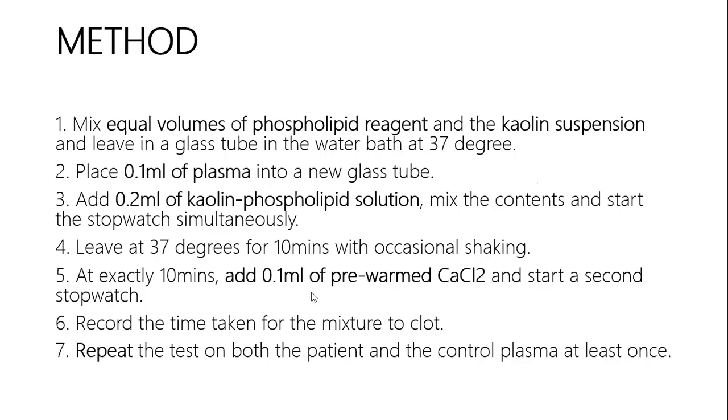So here is the method for the APTT. And just to clarify, we don't have a video demonstration for the PT and APTT because we are lacking some of the reagents. Initially, what we only have in our laboratory manual is the PT. We don't have any steps at all or a laboratory guide for the APTT.